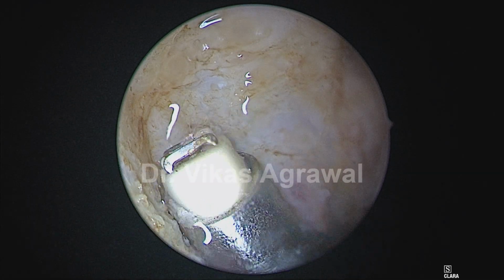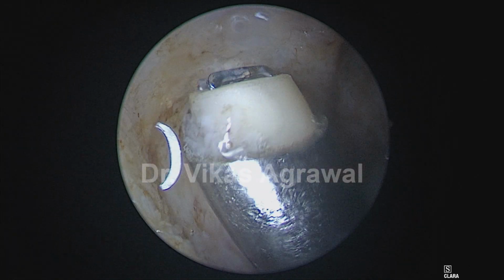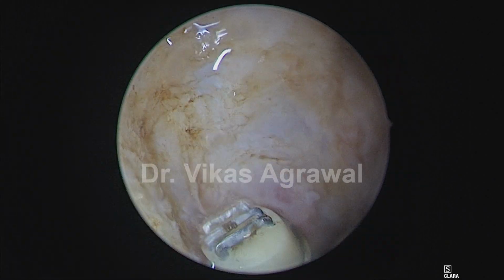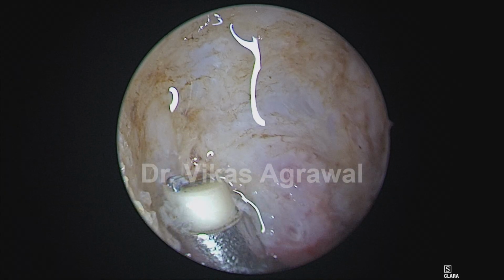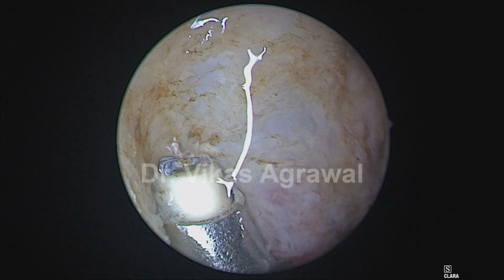So this is a work of 16 years. We started in 2008. We came out with a paper which is published in the Indian Journal of Otolaryngology in 2016, and this video is being made in 2024. So overall this is a work of 16 years. Now that's the fossa of Rosenmuller, which I am trying to completely clear.